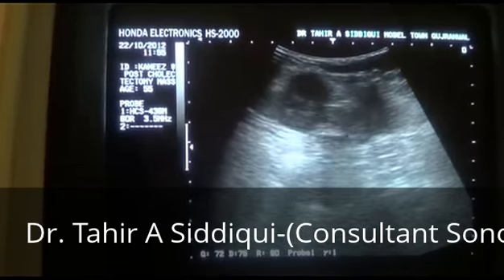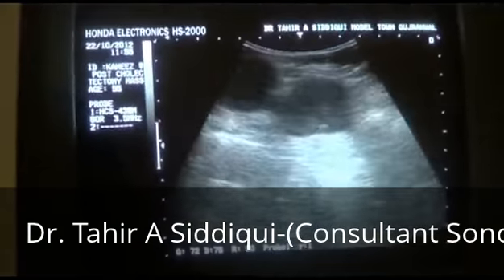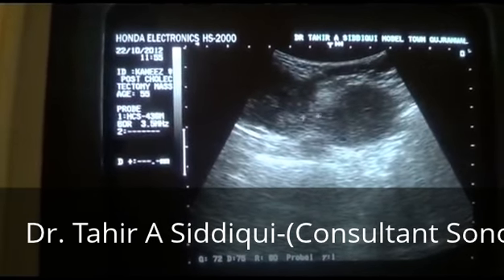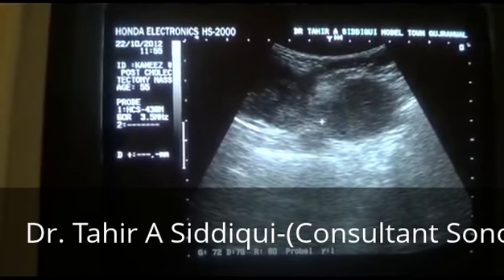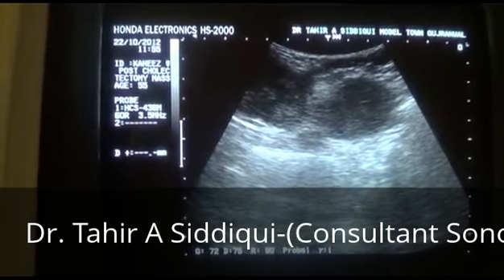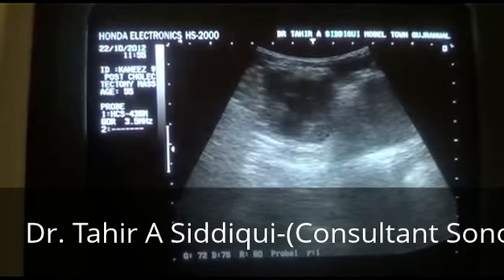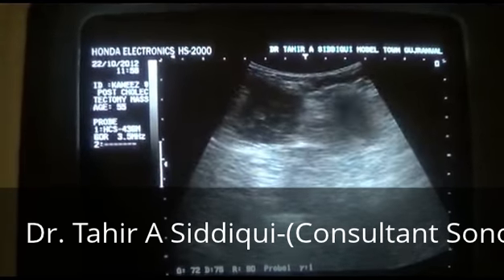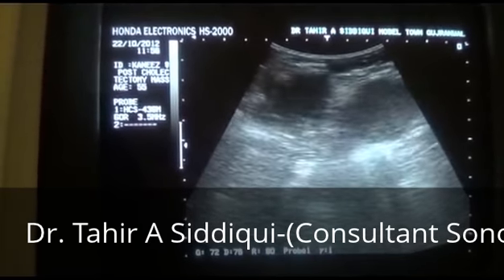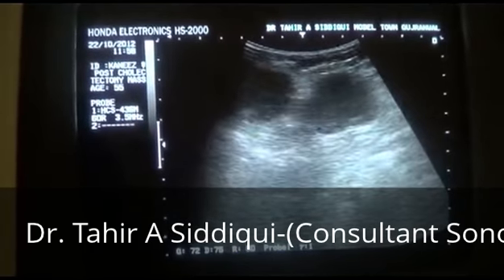It extends posteriorly and medially. This is the lateral one, and this is the medial one. And they are communicating with each other just below the skin. This is the peritoneal line, and this is the extraperitoneal masses, having internal calcifications, most probably consistent with collection of infective nature unless proven otherwise.